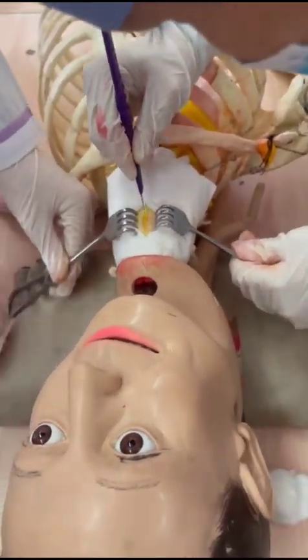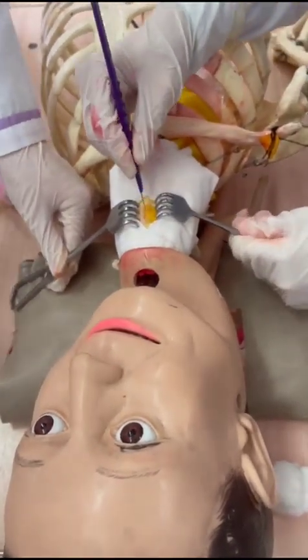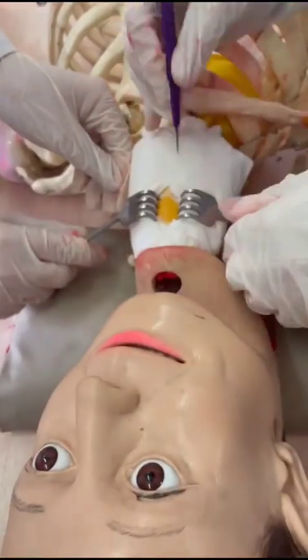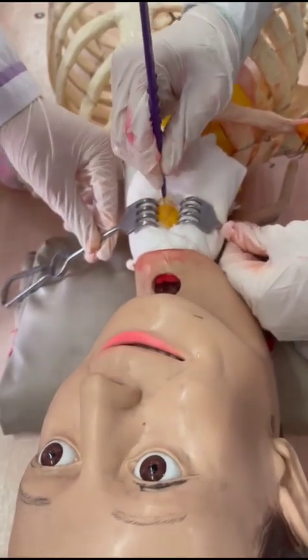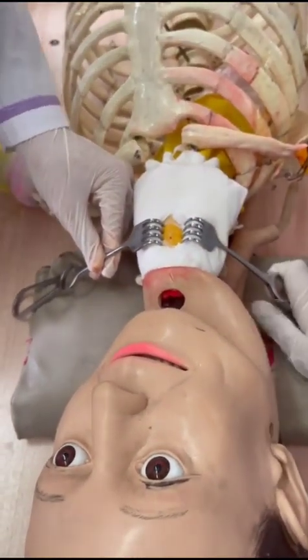Incision through skin and dissection through subcutaneous tissues is performed. Strap muscles are identified and divided vertically in the midline. Care is taken not to damage the anterior jugular veins, which usually lie slightly more lateral on either side of the midline. Identification of the thyroid isthmus is carried out. One should identify any large vessels, especially thyroid veins, that are usually placed at the inferior border of the isthmus.